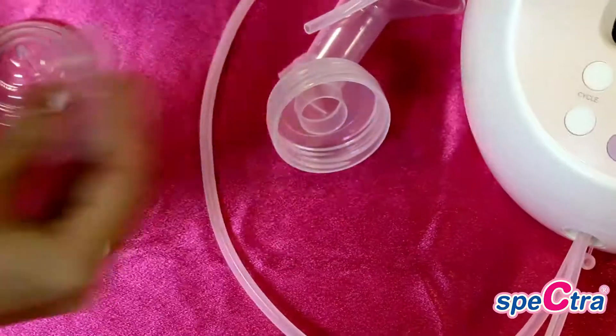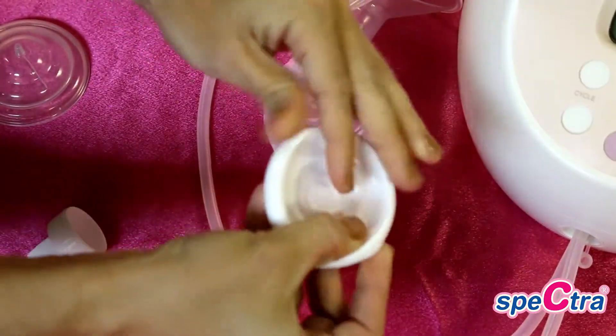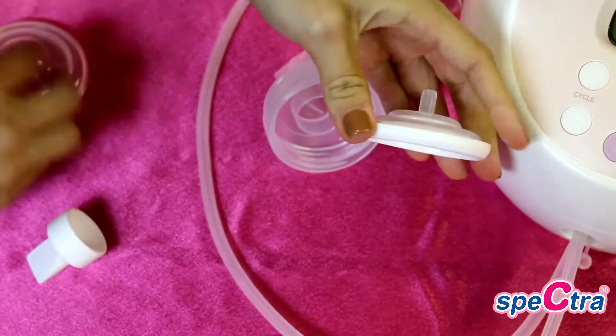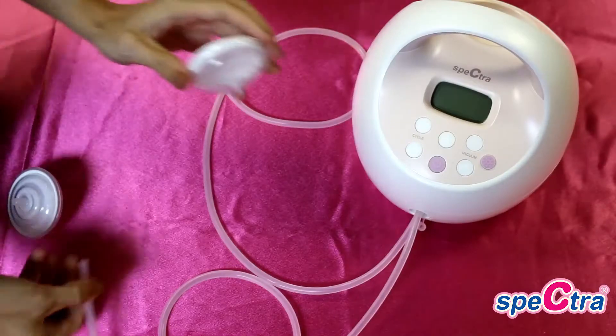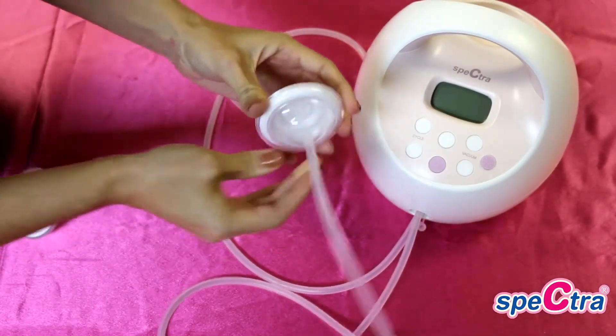For the backflow protector, you will assemble by folding the white membrane over the smaller casing and then pushing the larger and smaller casings of the backflow protector together firmly. You will then attach the backflow protector to the tubing by the smaller connector.